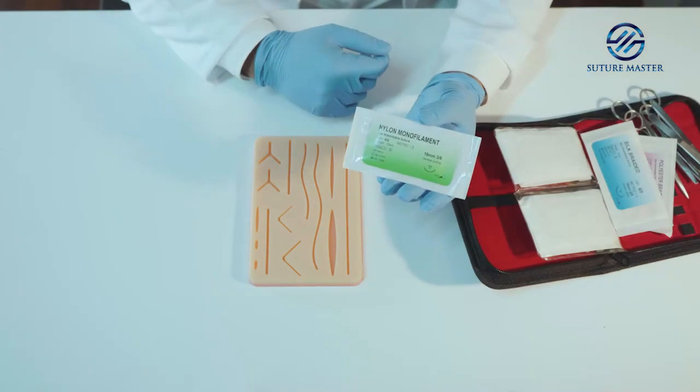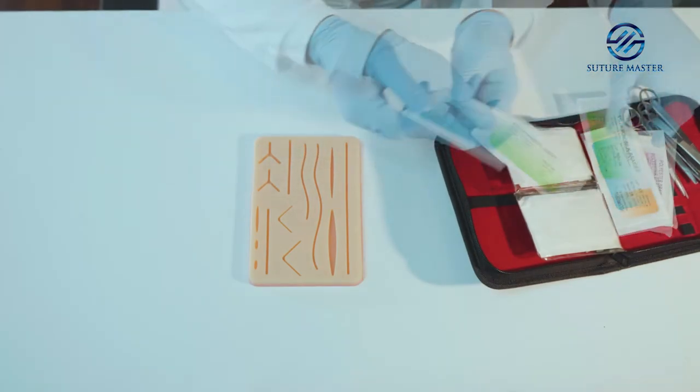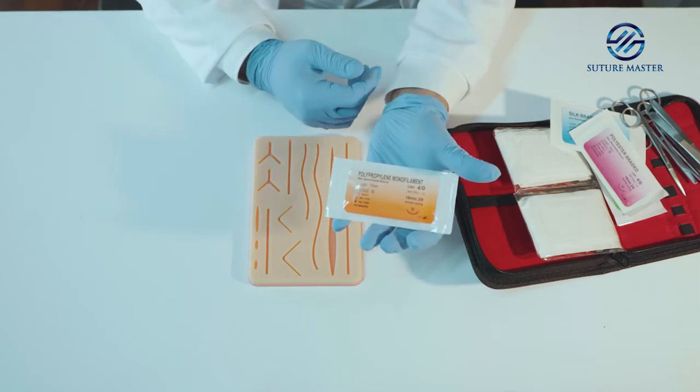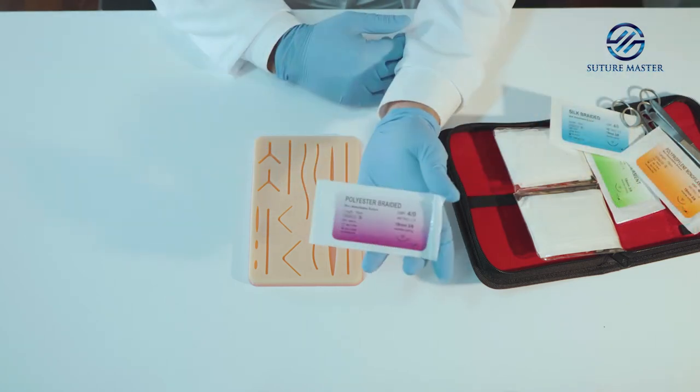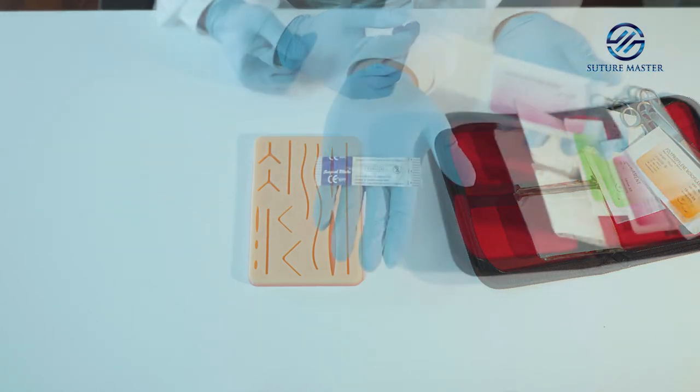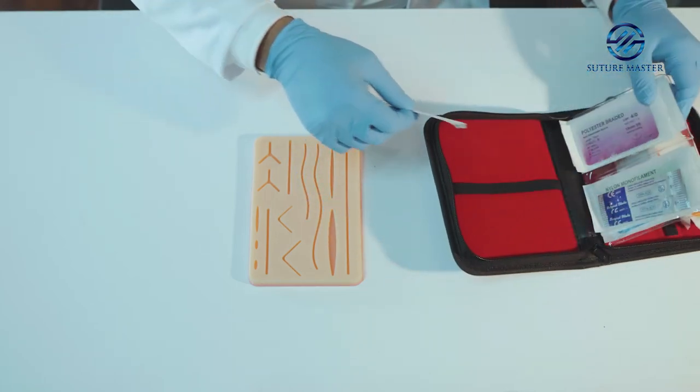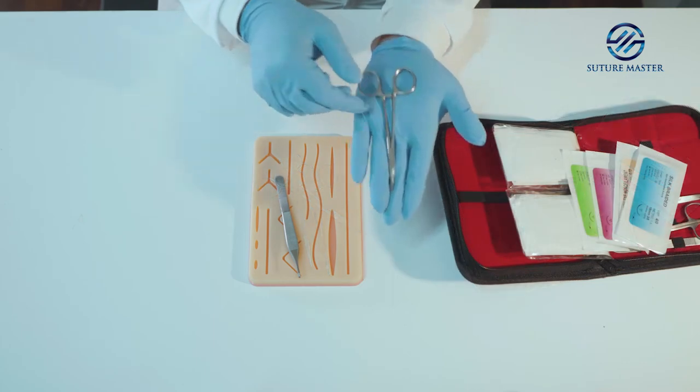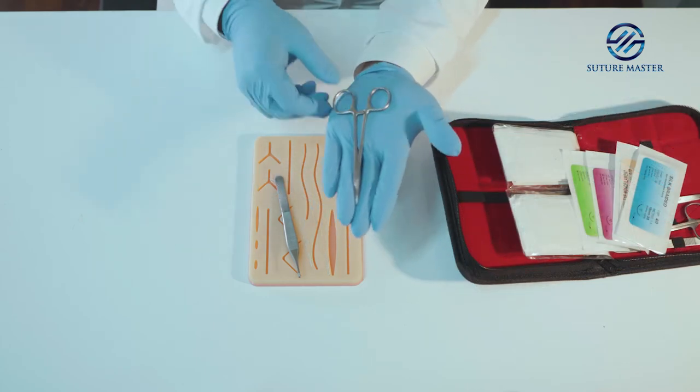The suture master kit also comes with nylon, silk, polypropylene and polyester suturing threads, three scalpel blades, one scalpel holder, one curved cali forceps, and a pair of gloves.